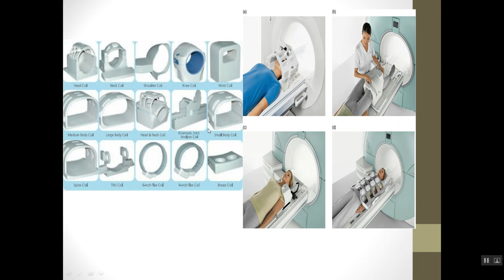Okay, here I'll show you some different types of radio frequency coil. As I said before, there are different types of coil specific for different body organs. Here for the brain, here another coil for the knee, another coil here, the dorsal coil, a flexible one, here for shoulder joints, another coil for the wrist, and so on. We'll find some surface coils, and there are different coils, each one specific for a specific organ. These coils are responsible for receiving and transmitting the radio frequency pulse.